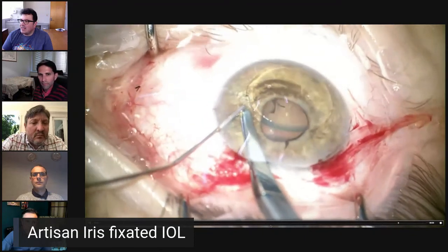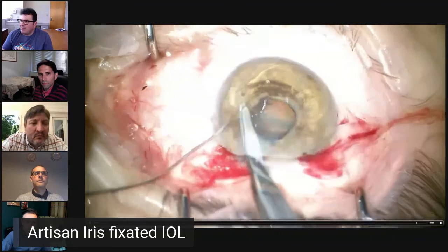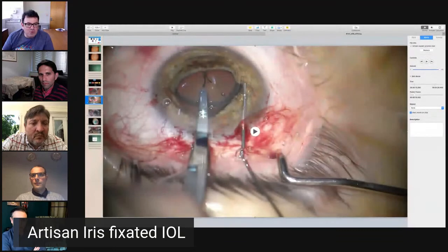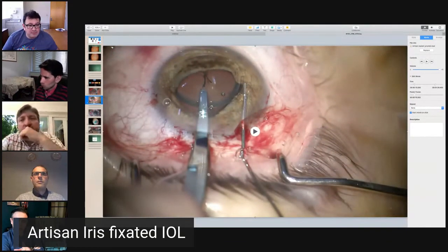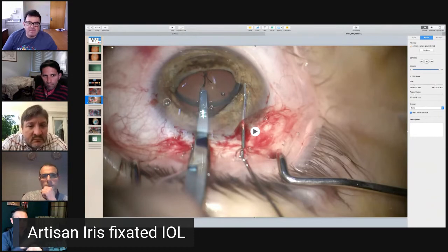And I didn't find any literature on that, but I think it's something that I learned myself. Really, so you hold near, and then it tends to work. Can I also suggest, Ahmed, maybe it's also a good thing to use an iris hook or something a little bit less thick than the cannula that you were using, to be able to bypass that clip area. So that's what I do in these types of cases.